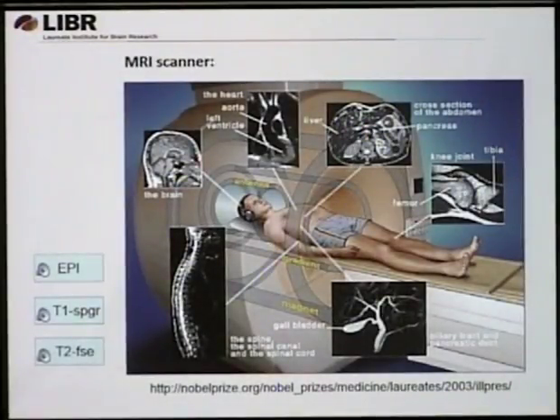Well, we need some equipment to do so, and it's called an MRI scanner. So this is how it looks, almost. This is almost the whole MRI scanner. I'm going to show you other pieces of it later on. But essentially, this thing is like a big magnet. This magnet is constantly on, so a magnetic field is generated inside this magnet. Then we can put the patient in, as you can see.